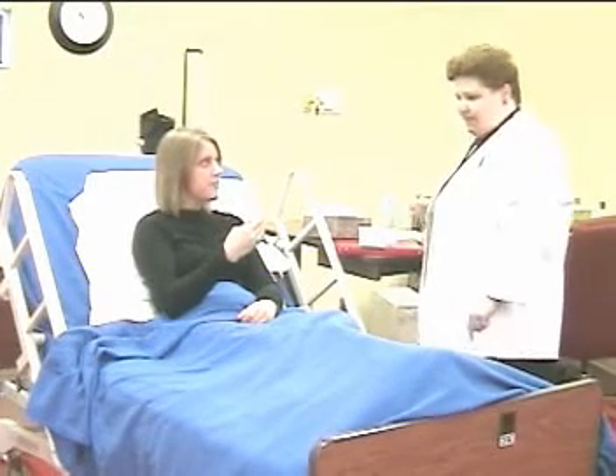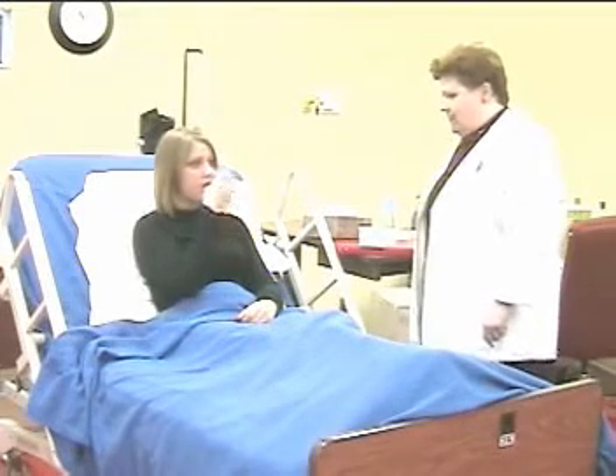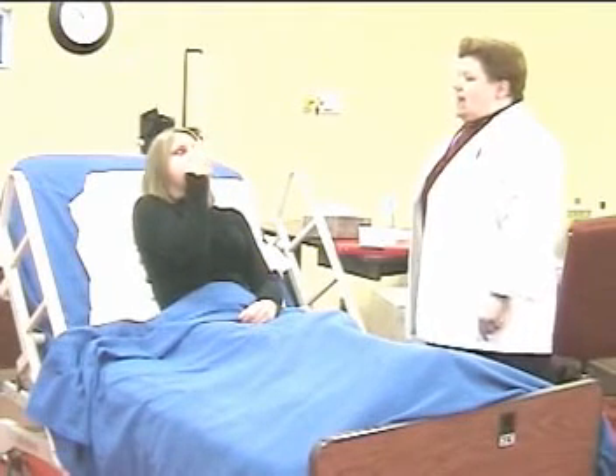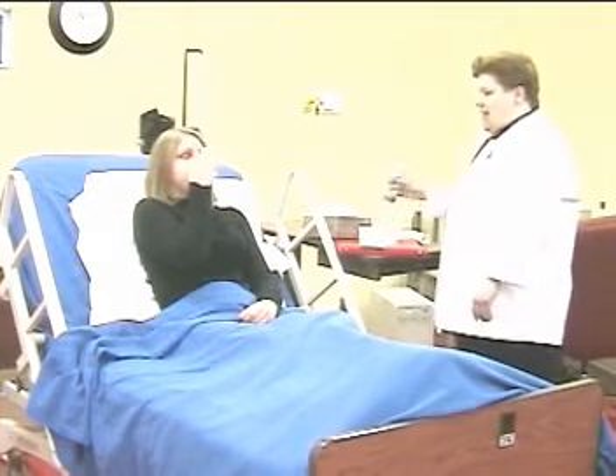The doctor ordered two puffs on the inhaler every four hours, so try that one more time. Inhale — keep going — and hold, hold, hold, and exhale.